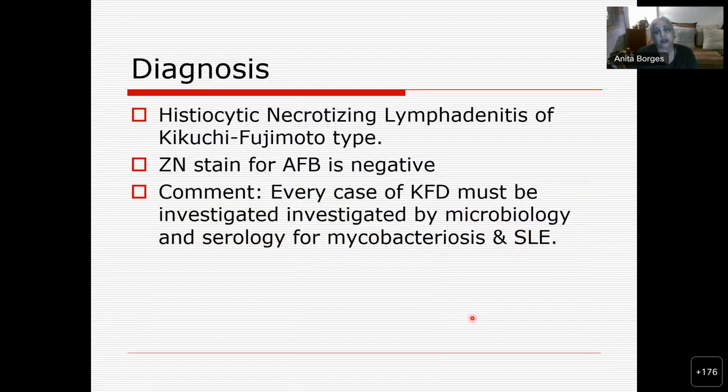But every one of these should have a stain for AFB done, because I would say at least 10%, if not more, of the Kikuchis that we want to call Kikuchi have tons of AFB, because Kikuchi is just a reaction. It is not a specific disease. We don't know what causes Kikuchi's, and non-reactive tuberculosis also gives you this kind of reaction, this kind of histology.